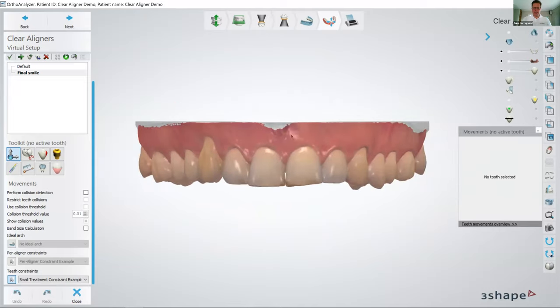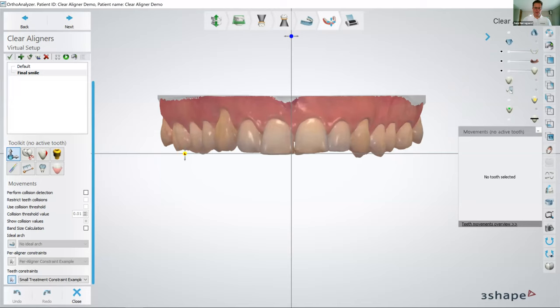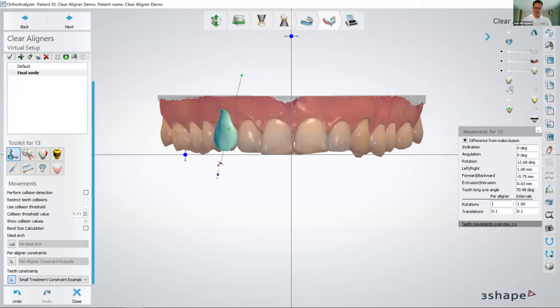If we take a front view, then we have some additional tools that can help us to create symmetry for the patient. So we have these symmetry lines that we can activate, and then you can move them around. Let's say I want to have my canine at the same level, then I can use this line as an aid or a guide, just to make sure that the teeth are aligned the same way to each other. So just go like this. Let's tip this tooth a little bit. So here we go.